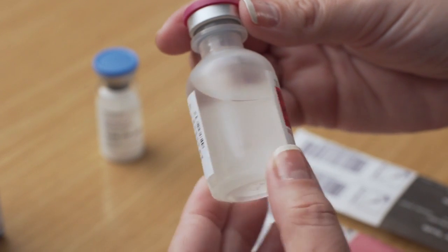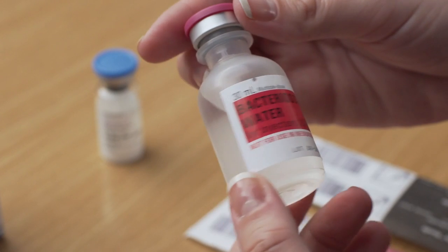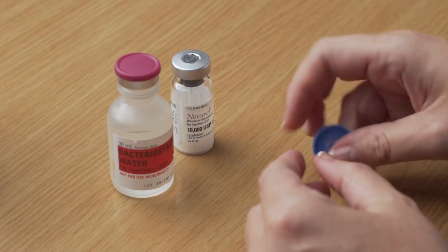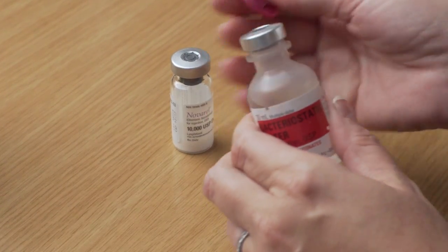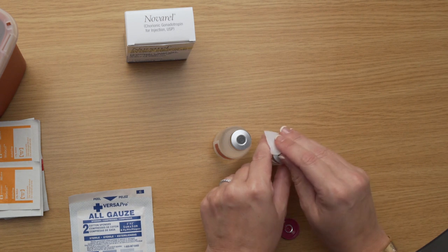Check that the sterile water is clear and colorless. Do not use if the solution is cloudy or discolored. Before you can inject the powdered Novarel or HCG, you have to mix it with the sterile water to turn it from a powder into a liquid. Using your thumb, flip the protective plastic caps off the vial of Novarel or HCG powder and the vial of sterile water. Use an alcohol swab to wipe the top of each vial.